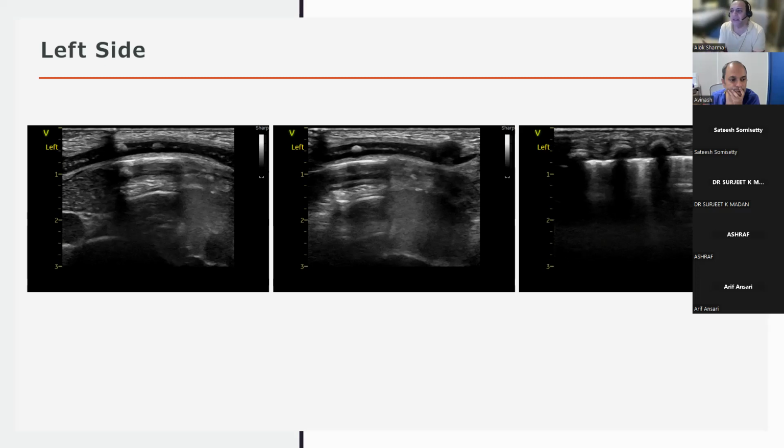A good example is with TTN babies, the backs of the lungs are usually poorly aerated and very wet. So we talk about lung ultrasound scores in these babies in the posterior regions, they're always high. Now, if I've got a double lung point and transitioning aerated lung, really, I've got a bad B profile with whiteout at the back, and I'm doing the supine areas and I don't want to disturb this baby, then what I might do is another scan, maybe in a few hours.